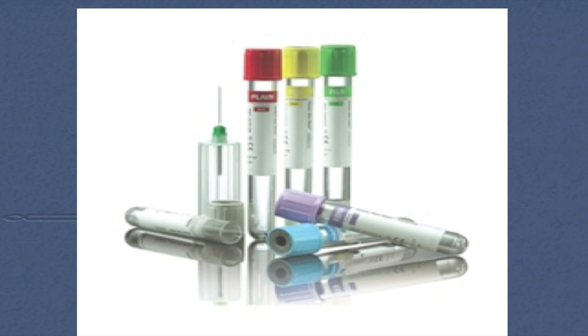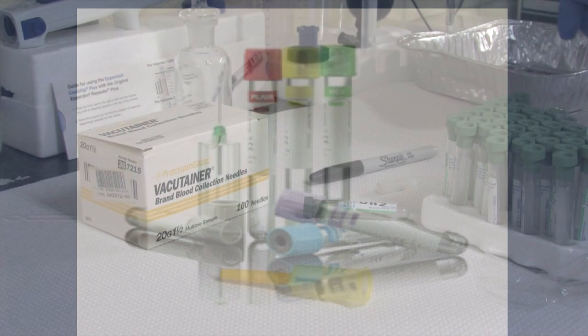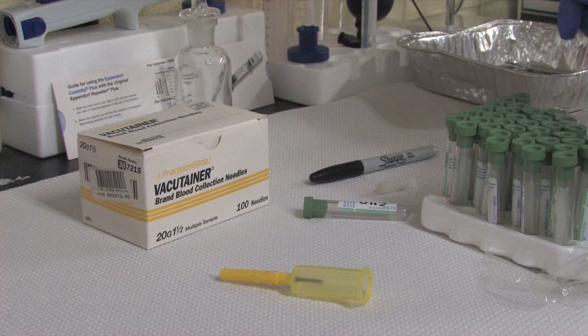The blood tubes can be different based on what type of testing you will be doing for your small ruminant. Be sure to check what type of blood tube you will need for the laboratory procedure to be completed. After all the materials are gathered and you know what type of blood tubes you will be using, you are ready to collect your blood sample.